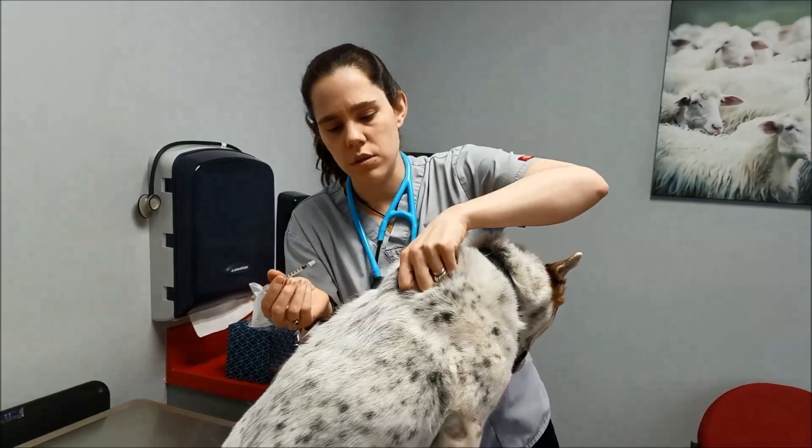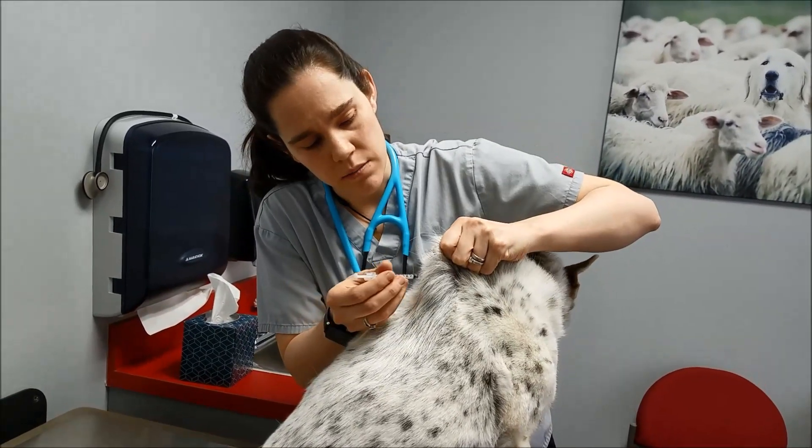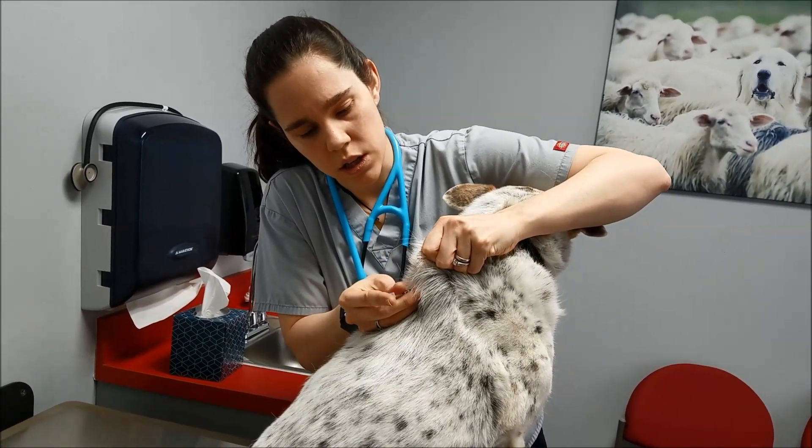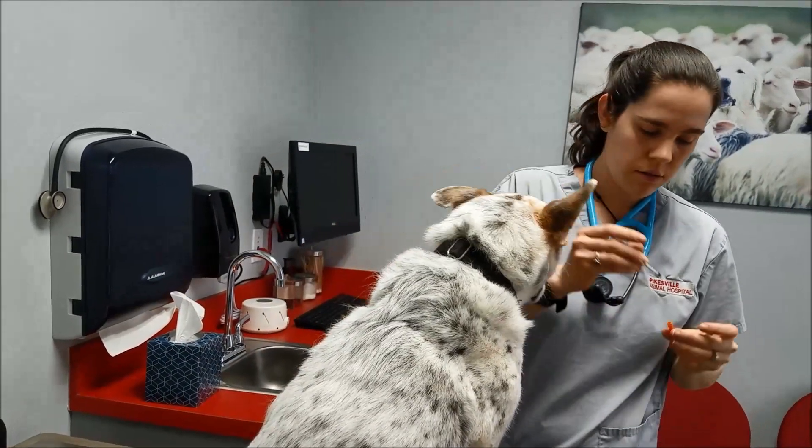When you have these little needles, you want to make sure you only poke once if you have to. So we go in, inject, pull out, and you're done. Pretty simple.